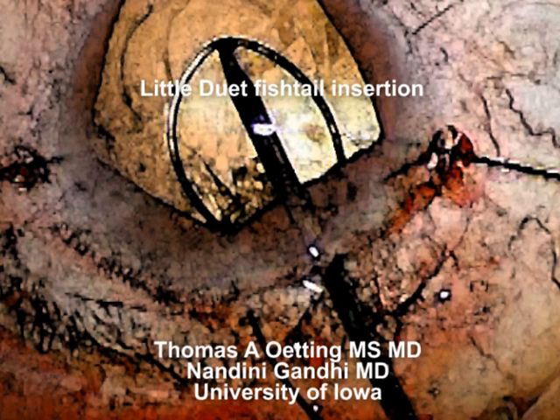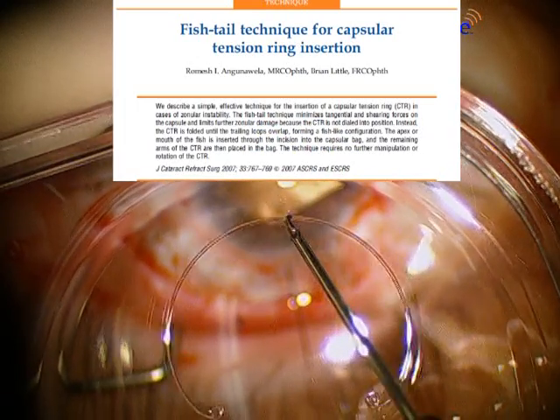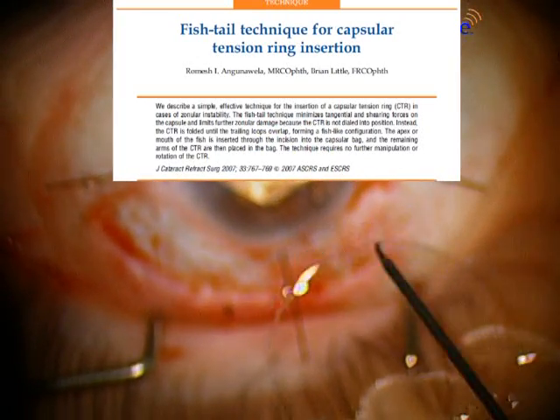Hi, this is Tom Oetting at the University of Iowa. I'm going to show you a case that Dr. Gandhi and I recently did, where we modified Brian Little's fishtail technique for placement of a capsular tension ring.